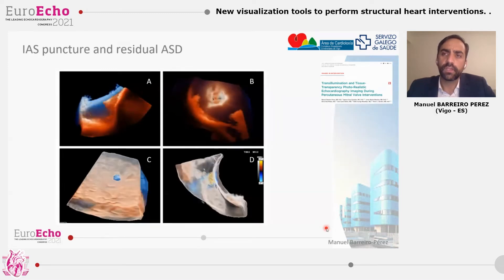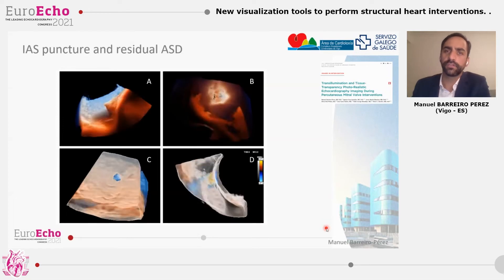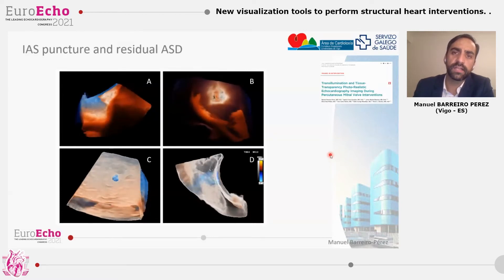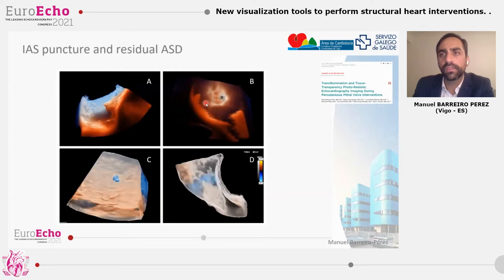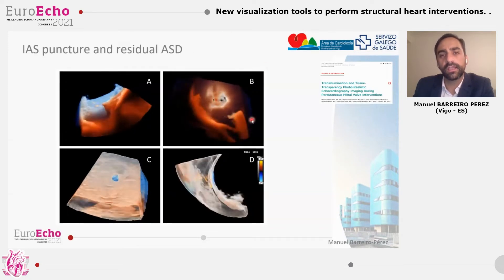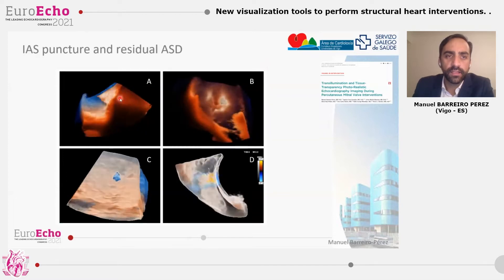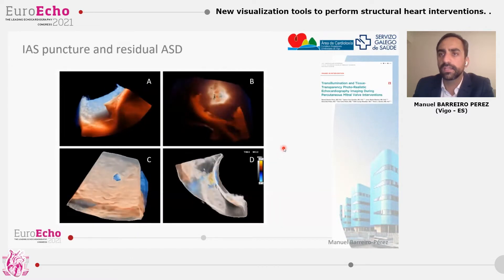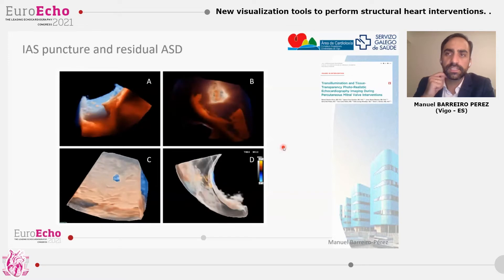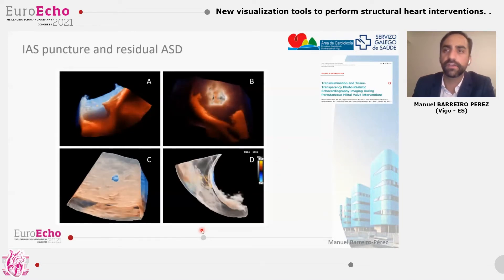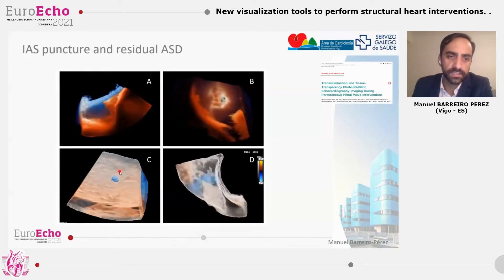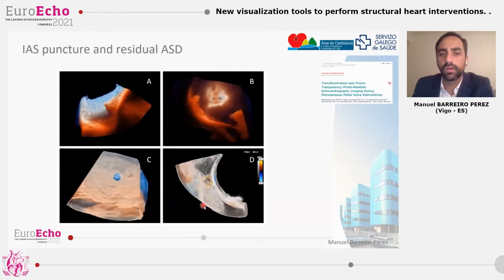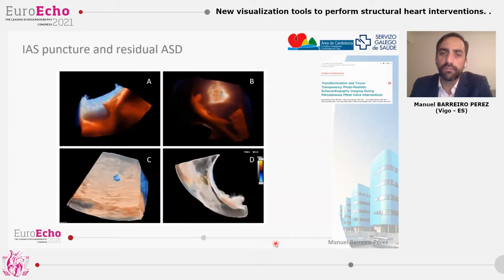One of the steps included in many procedures is the interatrial septal puncture. We need to puncture inside the fossa ovalis, and the fossa ovalis can be located in a really easy way with transillumination by placing the light on the other side of the interatrial septum. You can note how the needle is just in the middle, making a clear tenting before crossing the septum. At the end of the procedure, we can often detect a residual atrial septal defect that can be studied with the glass view, which enhances the borders for a clearer assessment of the shape of the defect. If we add color to study the residual shunt — for example, in that case from left to right.